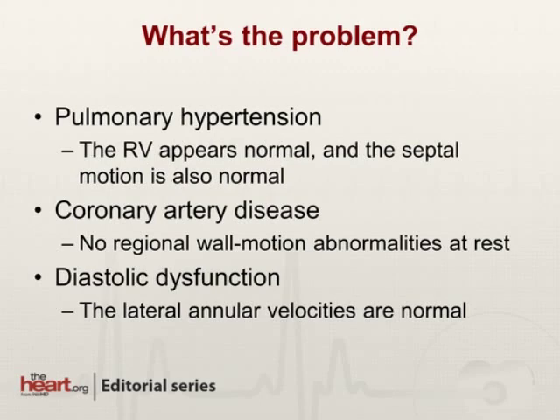Pulmonary hypertension would be unlikely from the 2D images that I showed you. The right ventricle appears structurally normal, the septal motion is normal, so there's nothing to suggest any overload on the right side of the heart. As for coronary artery disease, at least in the resting study, there are no regional wall-motion abnormalities. You'll also notice that the mitral inflow and the tissue Doppler of the mitral annulus are all normal, suggesting that there's no reason for this patient to have any premature stiffening of the left ventricle.